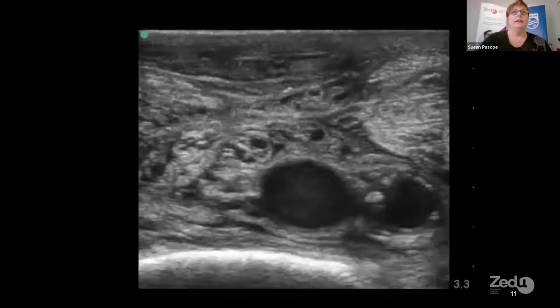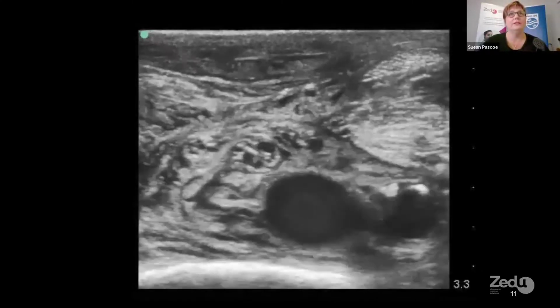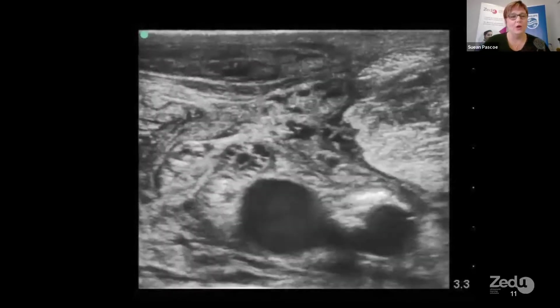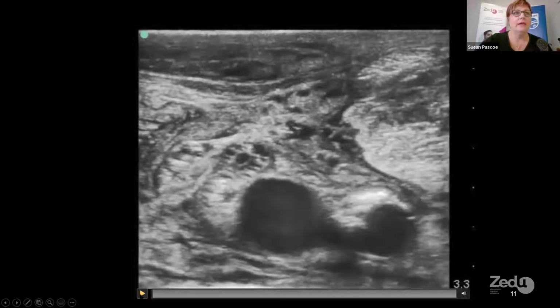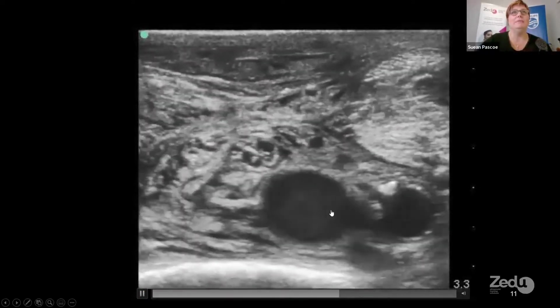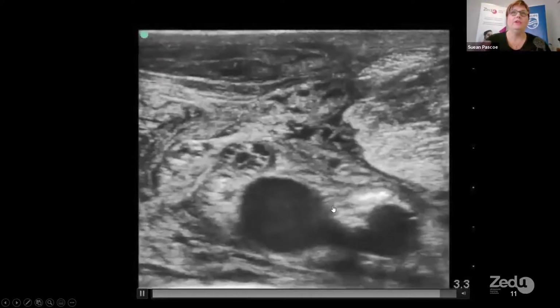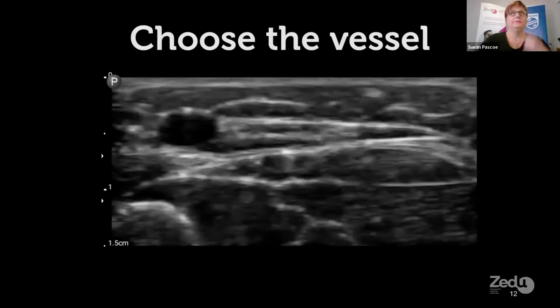Sometimes you might even see an example where you've got B mode flow. So in this example, the blood's flowing quite slowly in this patient. It's not clotted, and this video is not playing particularly well, but you can see the blood sort of swirling around just in B mode there. If you compress the vessels here, you'll see that it's easily compressed, and sometimes with the higher resolution equipment that we've got these days, you can see that B mode flow without even turning the Doppler on.